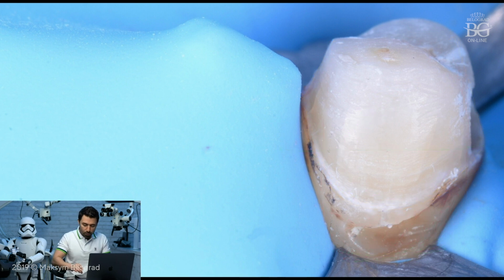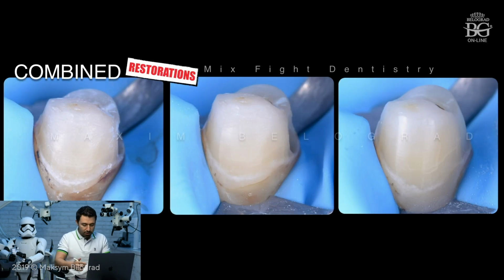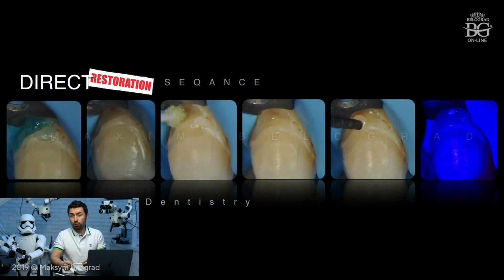So that's it, we actually did this type of dentistry. The crown later on will be bonded to enamel here, and the rest was done with a direct composite restoration, like a class 5. And you can see from the occlusal surface, I will give you another perspective. From the occlusal surface, you'll be able to see the true minimal invasive approach for that type of case.